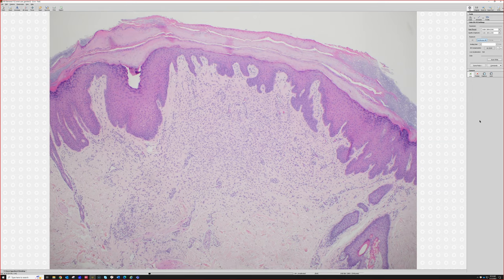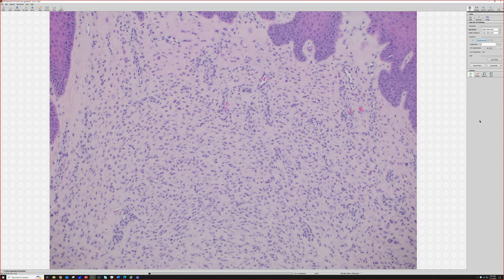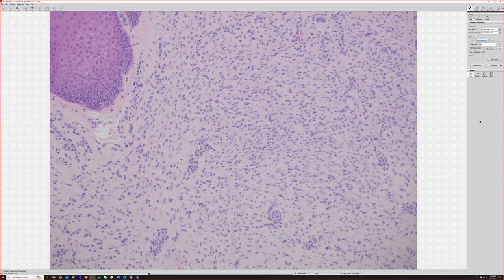All right. Anyone have a thought for this? This is a thing like once you've seen it a couple of times, you'll start getting a feel for it. I don't feel great about it, but my first thought was a DF. That's very fair. And some people, in fact, consider this a variant of DF, although it stains different, usually looks a little different, and it has different molecular findings. But for a long time, like when I was in training, this was thought to be a variation of DF. And again, some people still kind of hold to that idea.